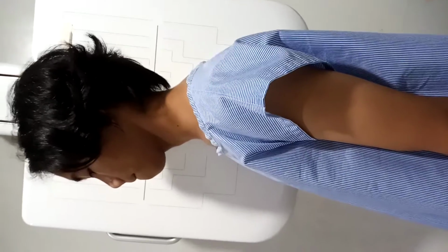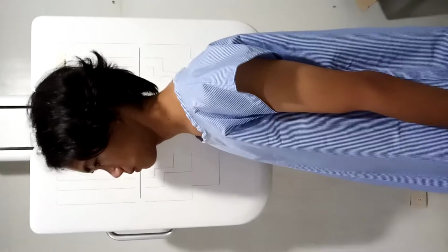The next position is thoracic vertebrae. Thoracic vertebrae AP projection.